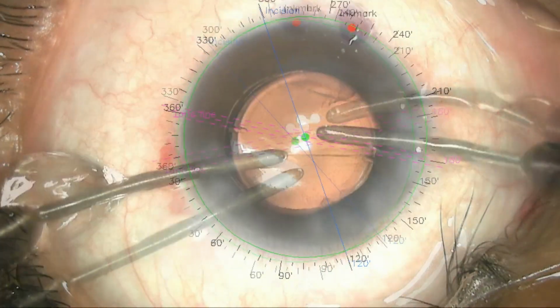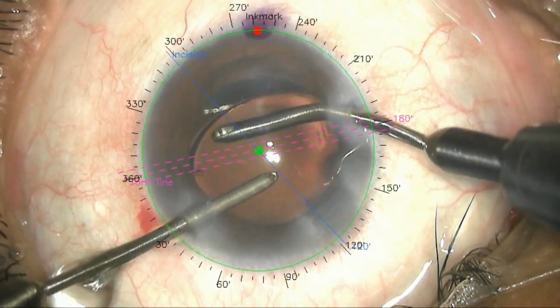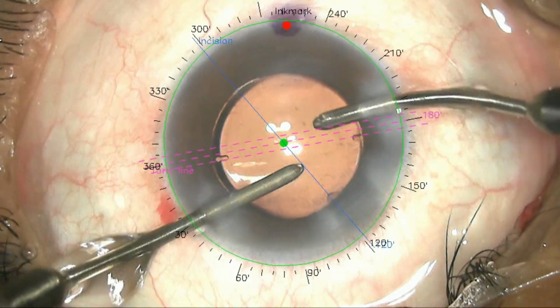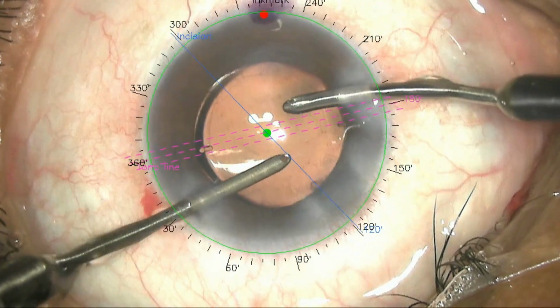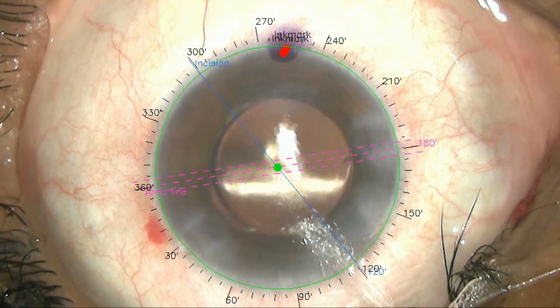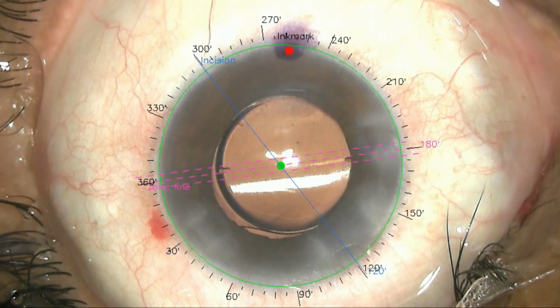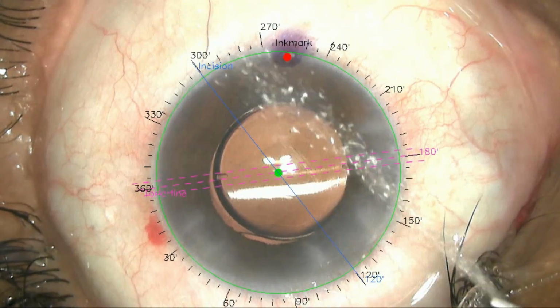So the pink color marks are the 3 marks for the Toric IOL placement, which is at 180 degrees. And now, as you can see, it is fairly aligned. It doesn't always have to be in the central line, it can be between the 3 lines. That much of error is fine. The IOL seems to be well aligned.